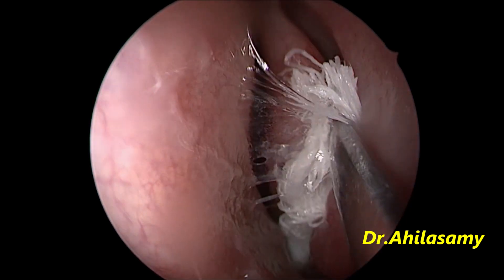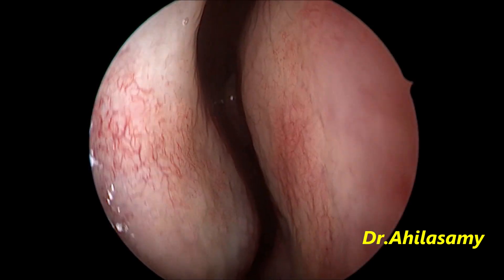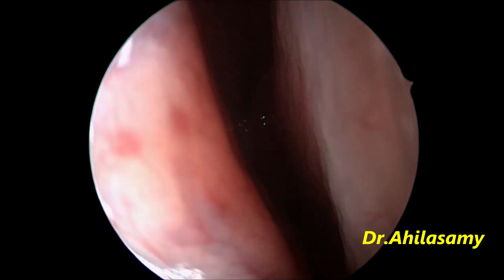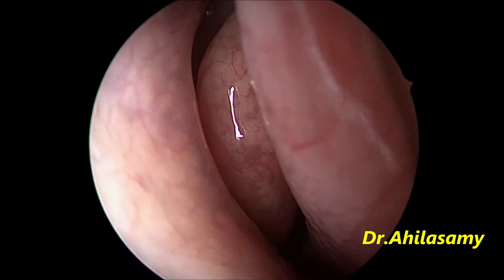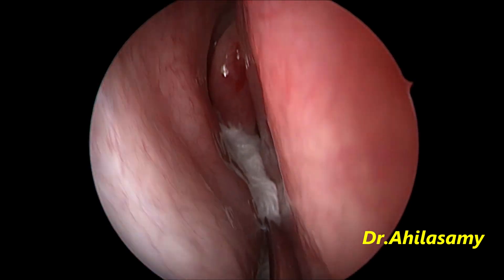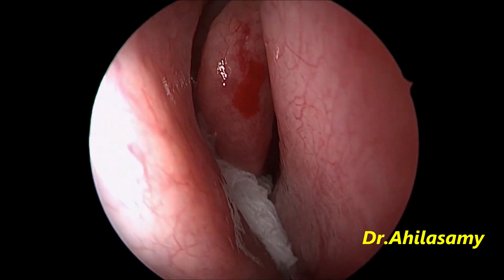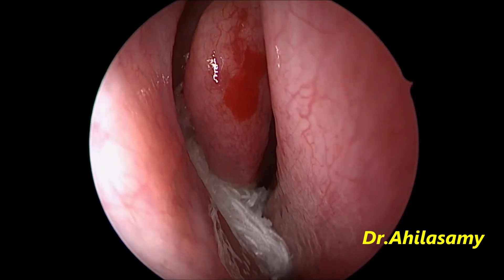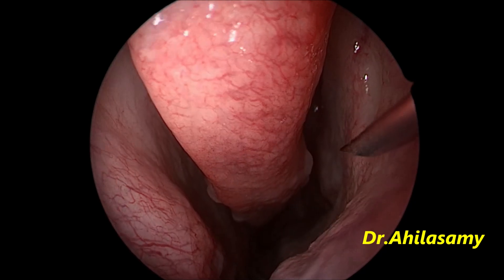Generally pack into the crevices, that is into the middle meatus. You can see the very badly deviated septum. You can see the middle turbinate — generally packing the middle turbinate and middle meatus crevices after repeated decongestant application.